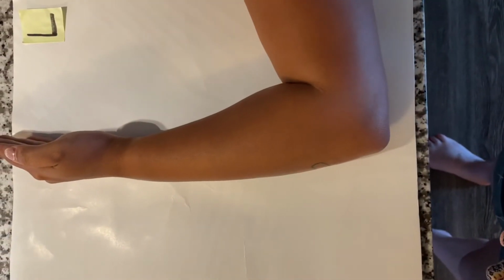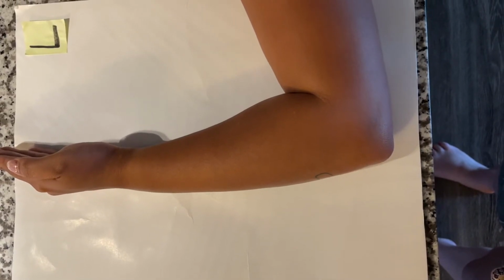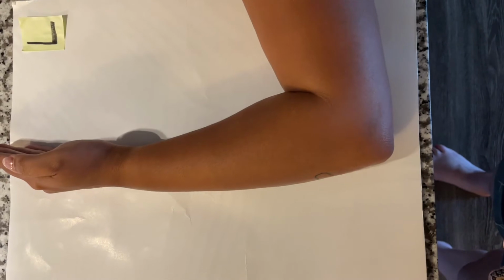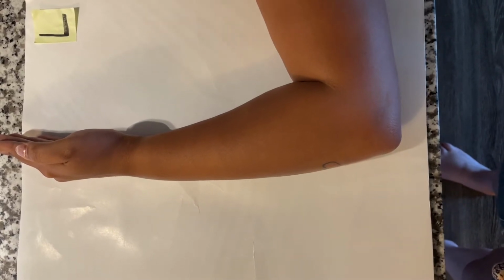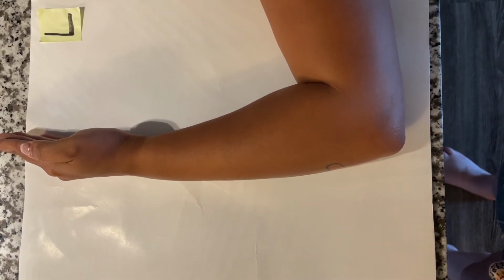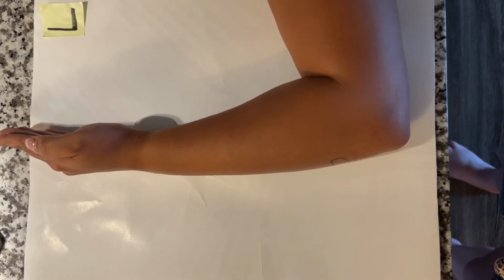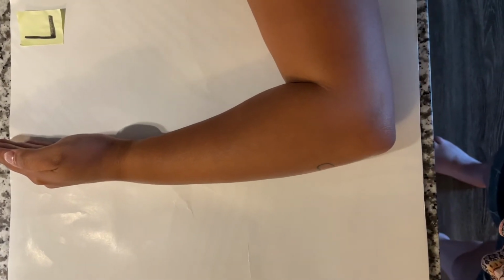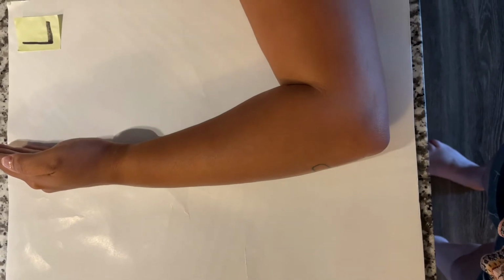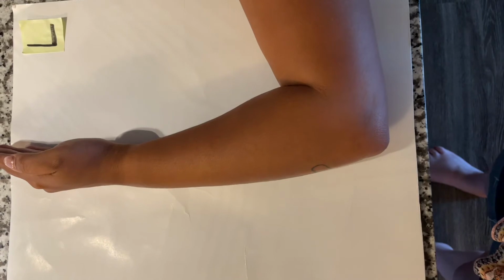For lateral forearm, we'll ask the patient to position the shoulder so that the humerus and shoulder are parallel to the table with the forearm. The elbow is flexed 90 degrees, then the hand, wrist, and forearm are rotated to a true lateral position resting on the ulnar surface, aligned to the humeral epicondyles and perpendicular to the film plane. The center ray will be directly perpendicular to the midpoint of the film.